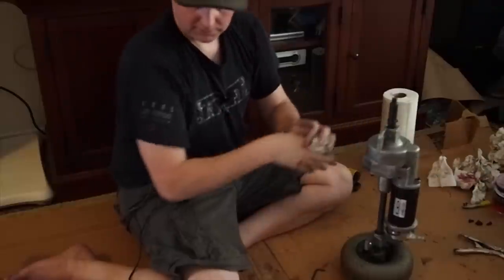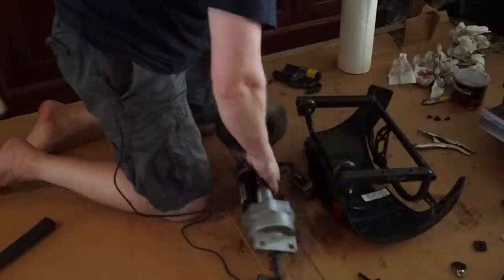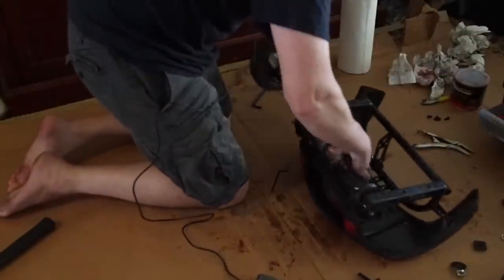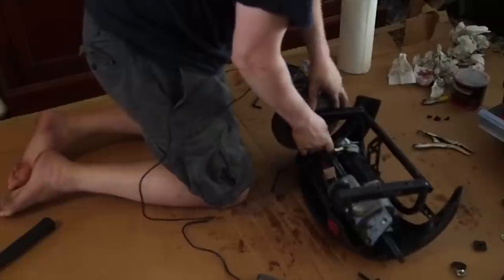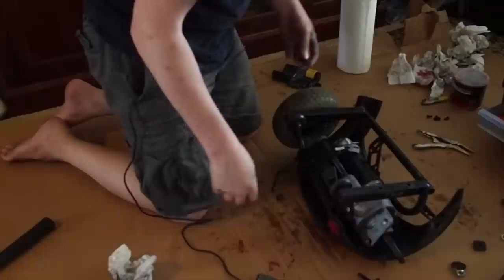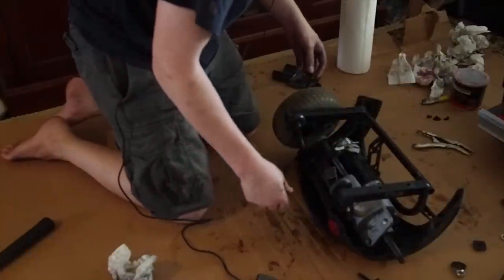All right, so the next step is to get this thing back into here. All of this is easy to do because this has to go in this way. You can't do it wrong, because here's the clutch. Clutch goes right in there, so this whole thing goes into here. I'm gonna put it in the exact order that I took it apart. I'm gonna bolt it up first, then I'll put the clutch back together. I'll do the wheels last. I'll probably put that wheel on first, and then we'll see about testing this thing in a little bit.